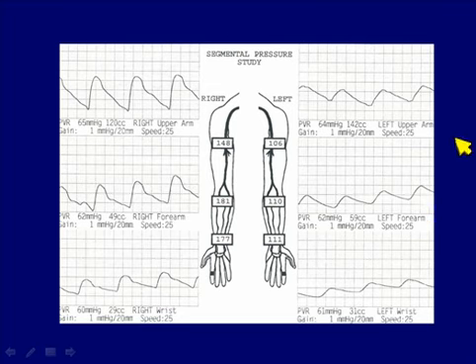So what we can safely assume is that the problem is at the beginning, that there is probably something up here in the subclavian leading down, so that when we take a look in the upper arm, we already see a change, and that change is probably the result of a subclavian artery stenosis.